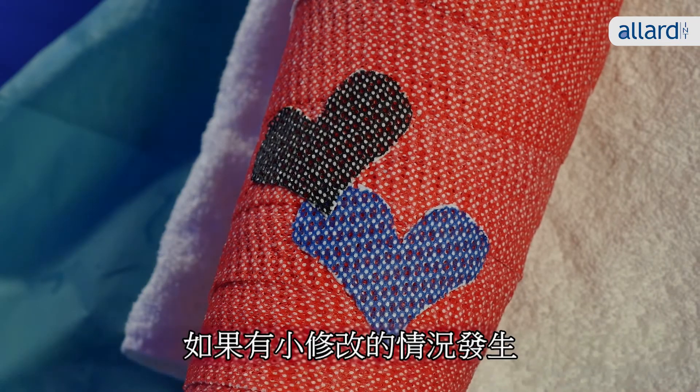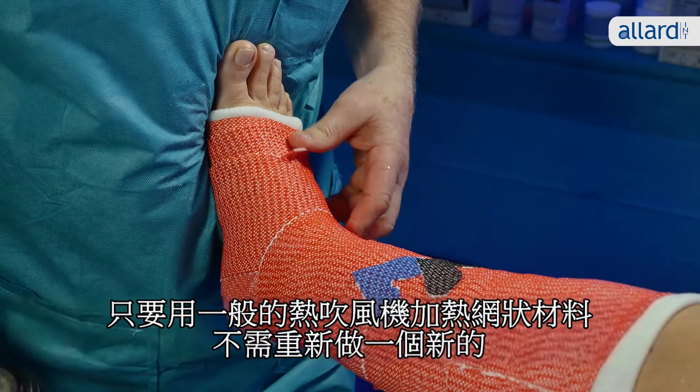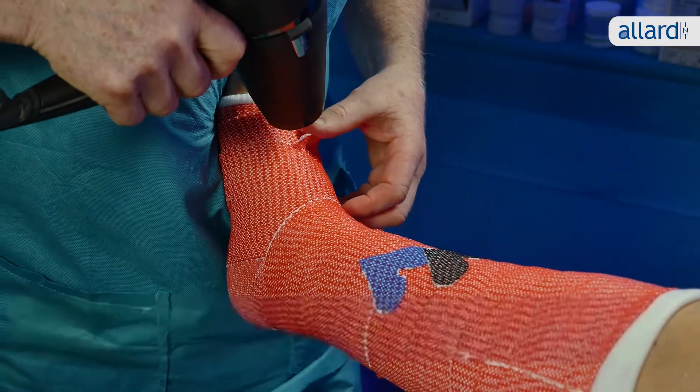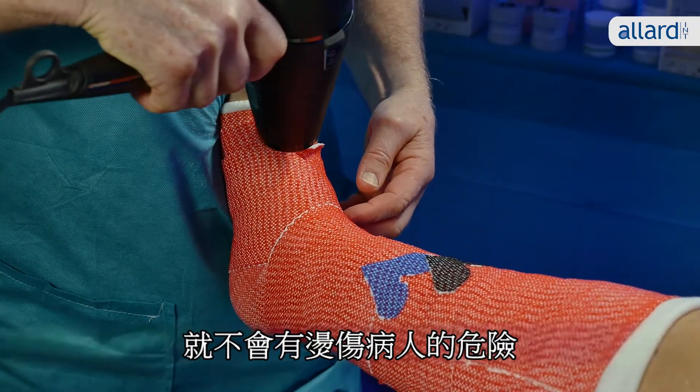If a situation occurs which requires small changes to your splint, you can use a regular hairdryer to reheat the material instead of making a new cast. Always keep your own hand near the point you are heating, so you don't risk burning the patient.